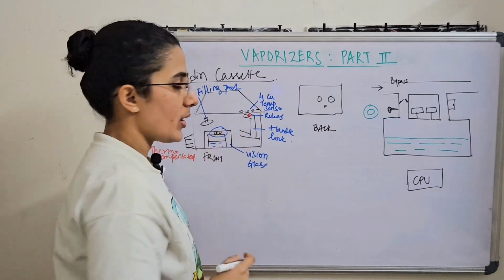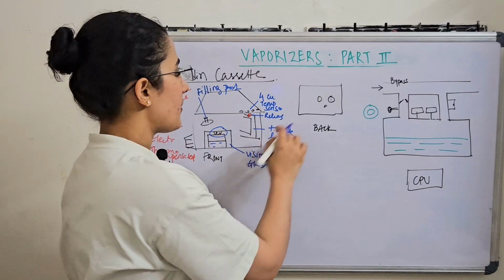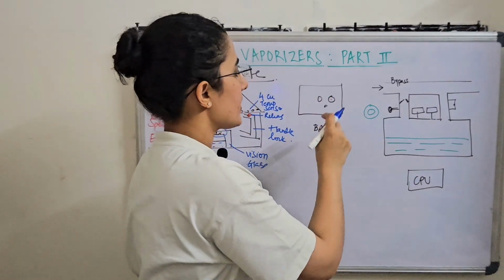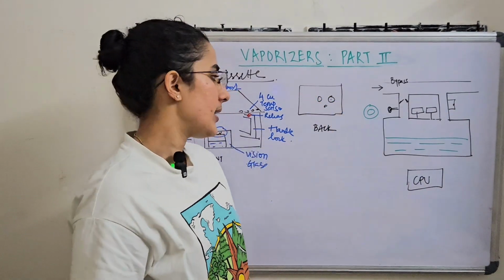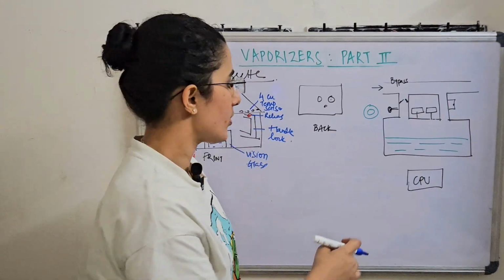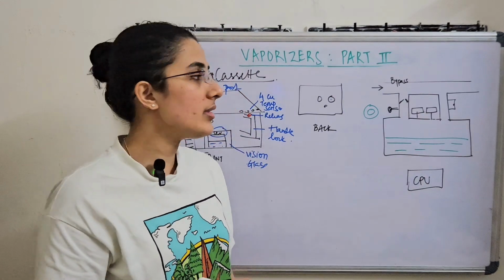Usually the agent name is also written and it is color coded. From behind, the Aladin cassette has 2 ports, an inlet and an outlet port for the gases, and also a temperature sensor may be present. So the Aladin cassette is one of the advanced cassettes for the delivery of the gases.